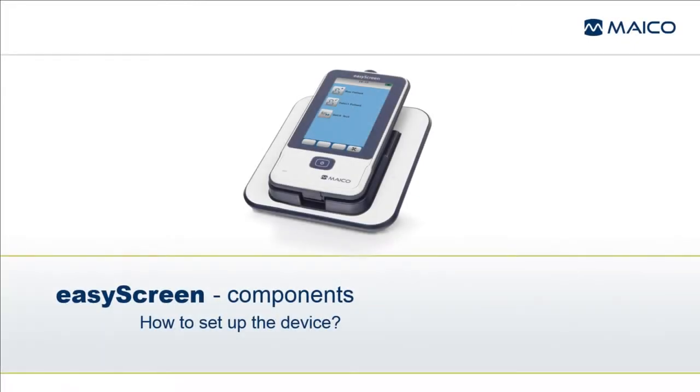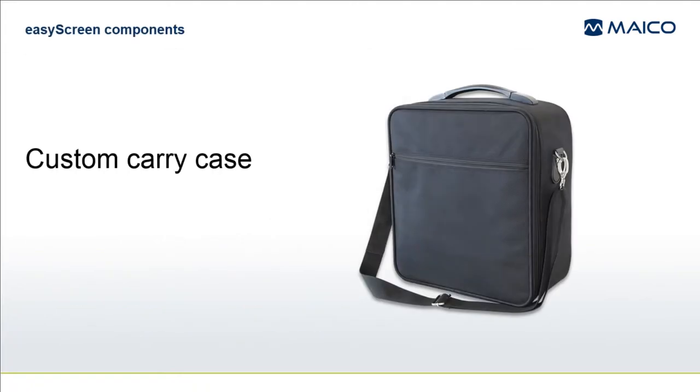This presentation reviews the components and setup of your new EasyScreen. The EasyScreen system and many of the accessories arrive packaged in a custom-designed carry case. The carry case provides protection during shipping and allows easy transport of the system for those who carry the system to various locations.